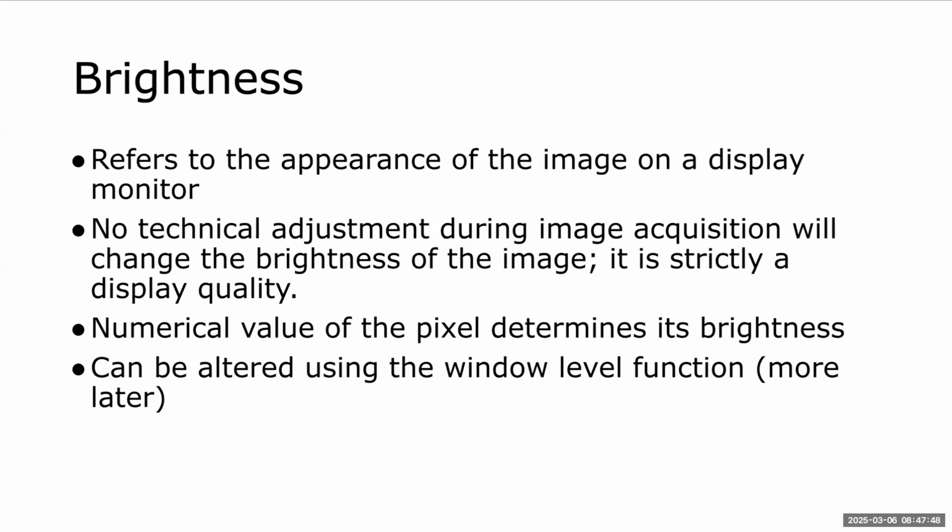With film, if we used one mAs on one image and we doubled that mAs, we would see the darkness change, what we call density, in that film. We don't really see that with digital imaging because the computer is constantly trying to correct exposure mistakes.